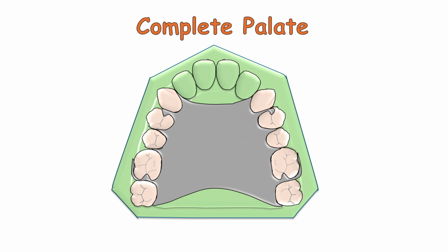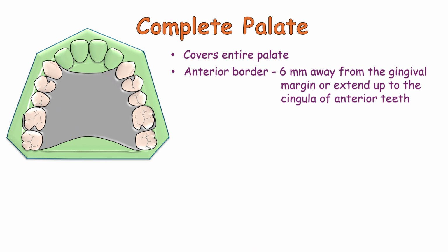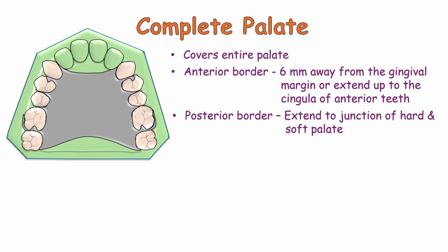Complete palate. It covers the entire palate. The anterior border should be 6 mm away from the gingival margin or extended up to the cingula of anterior teeth, and the posterior border should extend up to the junction of the hard and soft palate.